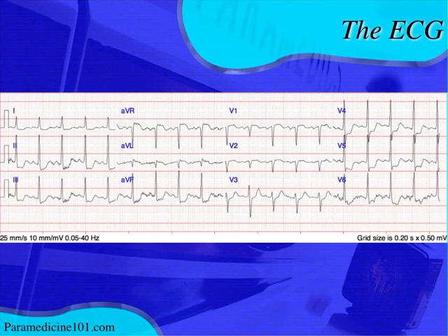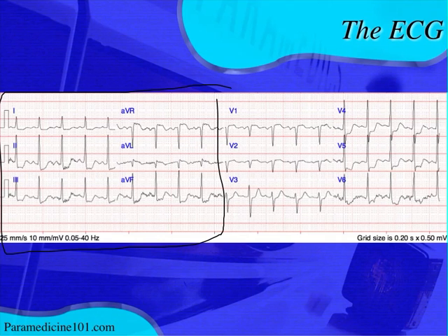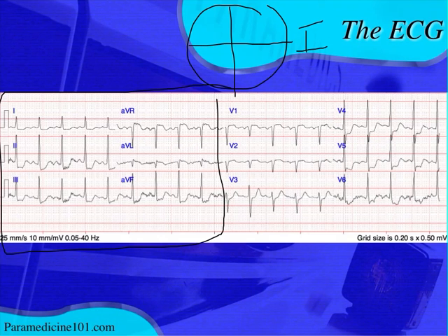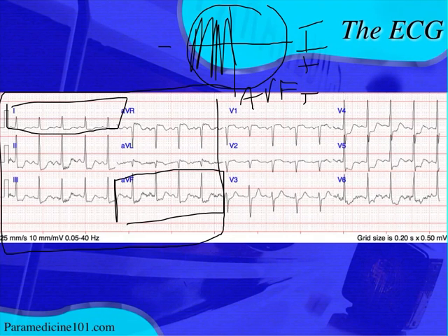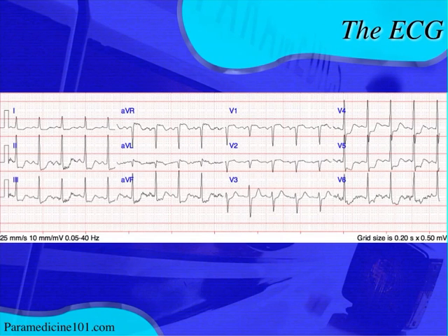First thing we're going to do is look at our frontal plane axis, so we're going to look at the first six leads. Using the quadrant method, you make a circle. Lead one is positive, so we shade out the negative side of lead one. Then we look at lead AVF — AVF is positive as well. Shade out the negative side of AVF, and we're in the normal quadrant. So we know that our QRS axis is normal.